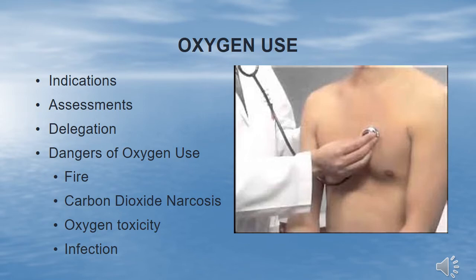Oxygen toxicity is another risk of oxygen therapy. Prolonged use at high concentrations can result in inflammatory responses such as pulmonary edema. Concentrations of 50% or usage longer than 24 hours increase the risk.